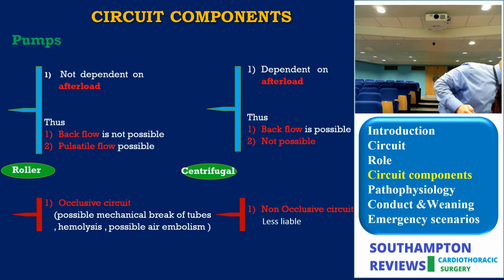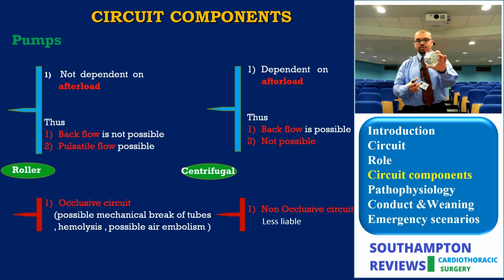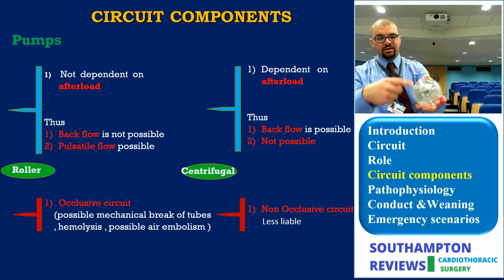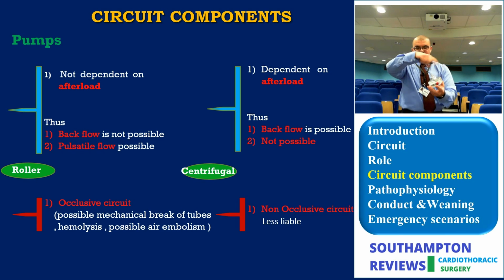Then the pumps. We are all familiar with the roller pumps. We have different types of pumps which are actually used. They are not completely out of use, which is the centrifugal pump. If you look here carefully, there is a centrifugal disc inside which runs around. It creates the centrifugal force which drives the circuit.